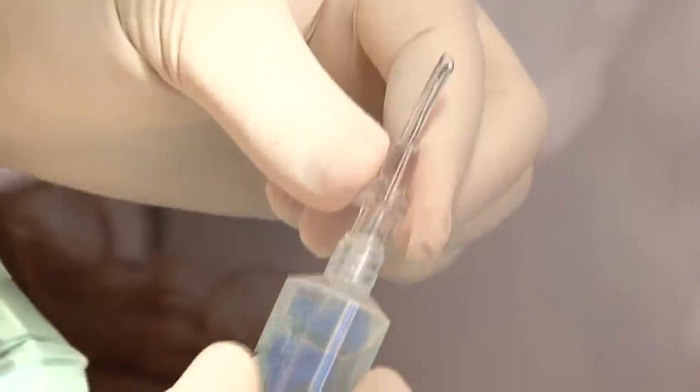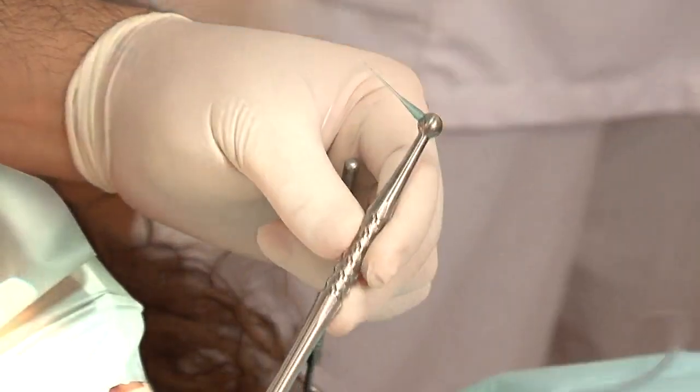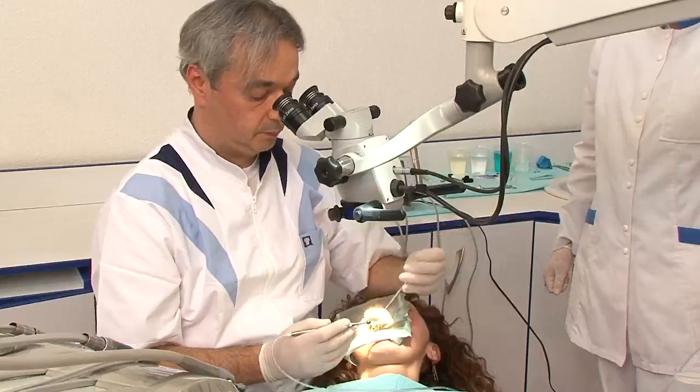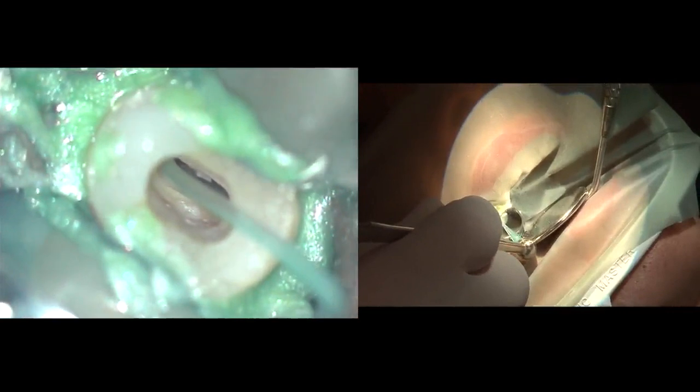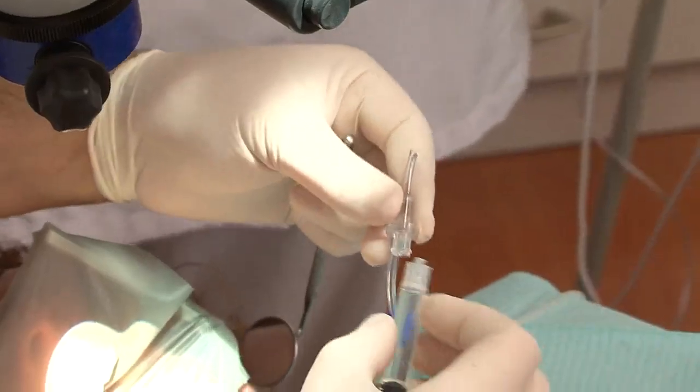Changing the main syringe can be easy. You can take another one that is fully loaded. Using the macro cannula for drying the previous chemical in order to avoid any dilution of the next chemical and inter-canal chemical reaction. You can also use it for drying the canal before taking the working length. We adapt the white tubes to the macro cannula and we use it to dry the canals from any previous chemicals before putting a different chemical. I'm using EDTA 17% to take out the smear layer that was produced during the M4 handpiece.